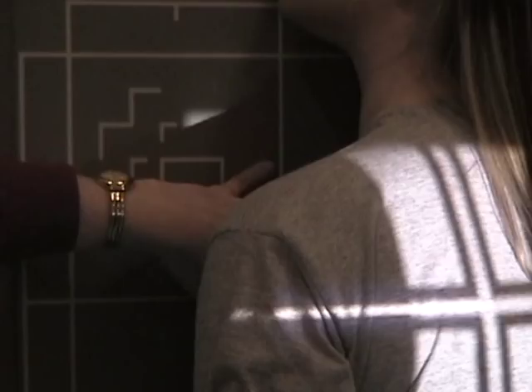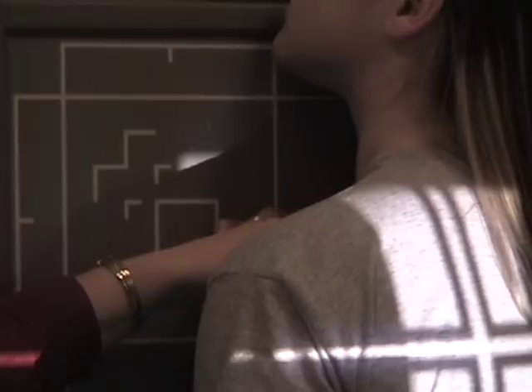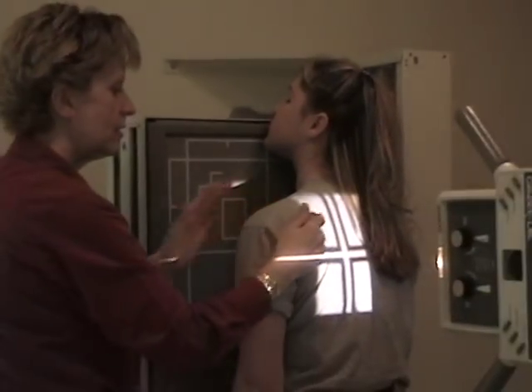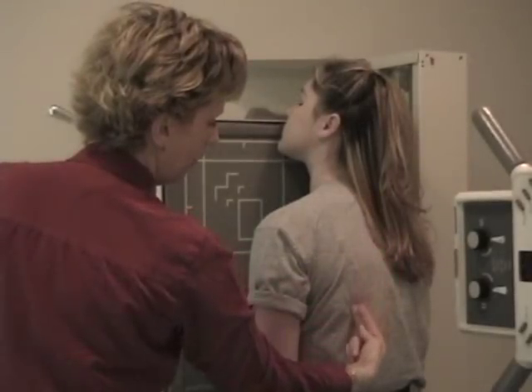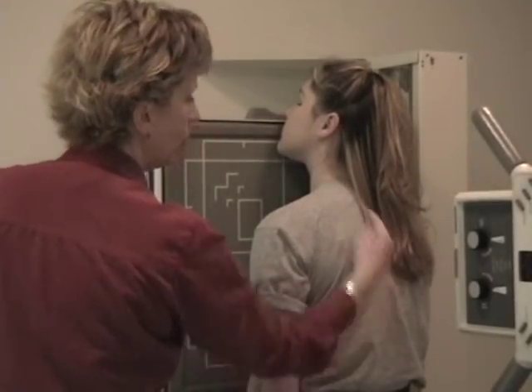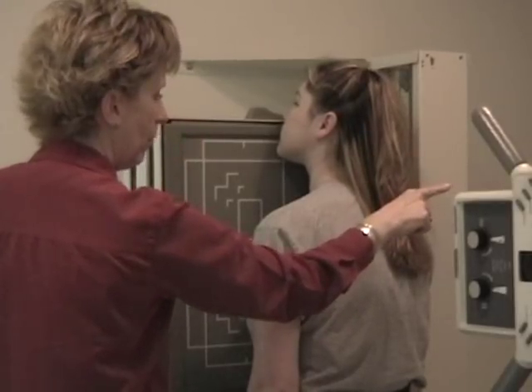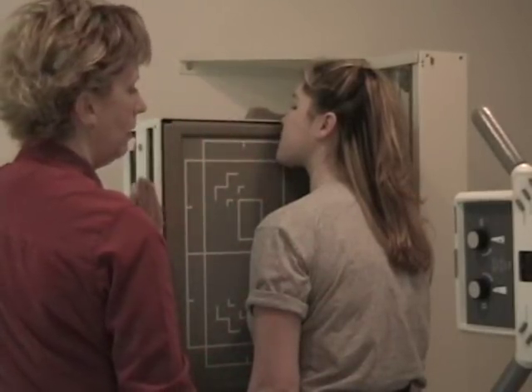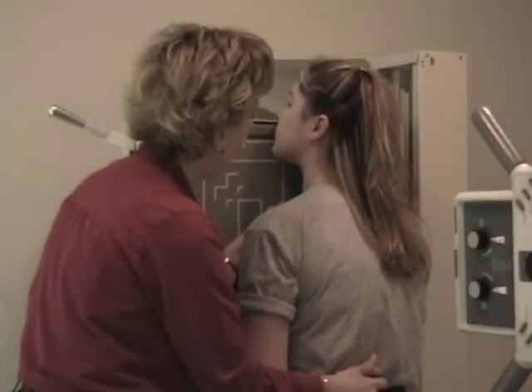Okay? I'm going to find her manubrial notch here, and I'm looking at the white line of the board. I want the manubrial notch to be just to the right, just to that side of the center of the board, because the sternum in this position, it actually goes manubrial notch and angles left down to the xiphoid. So I'm going to start with the manubrial notch being slightly to that side of the center of the film, because the xiphoid will then end up being slightly towards this side of the center mark. So that's how I've decided how to position the patient side to side.